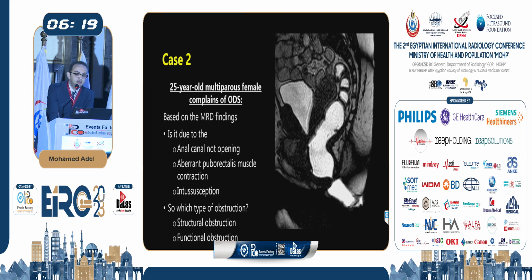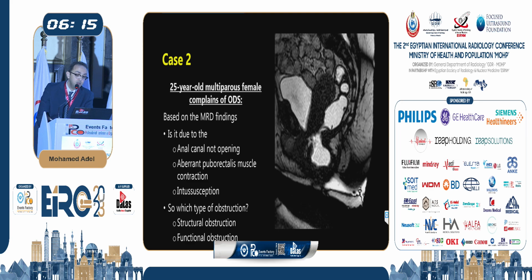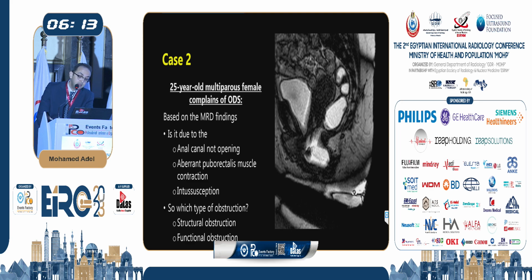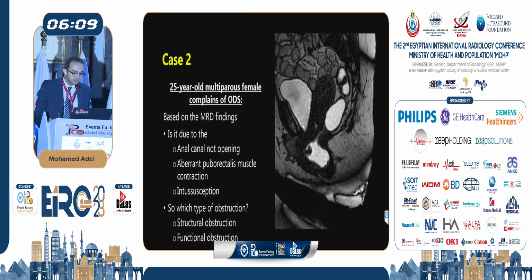So we can see that there's kind of a delay in the evacuation, but at the same time you can see that the anal canal is opening, and there's an abnormal structure that is causing the obstruction. Or I wouldn't say a structure, there's an abnormal function that's causing the obstruction. So I gave it away basically.